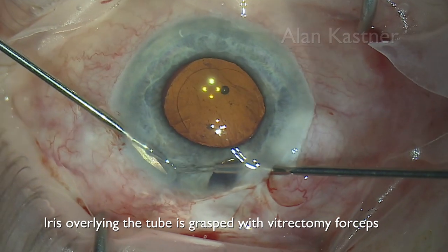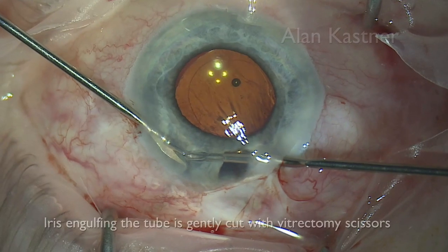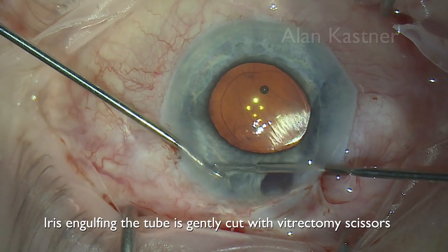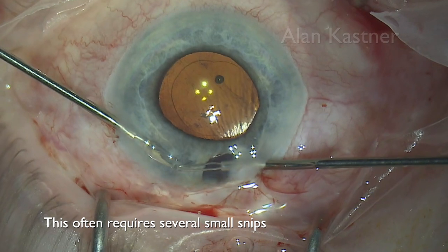Iris overlying the tube is grasped with vitrectomy forceps. The iris engulfing the tube is gently cut with vitrectomy scissors, and this often requires several small snips.